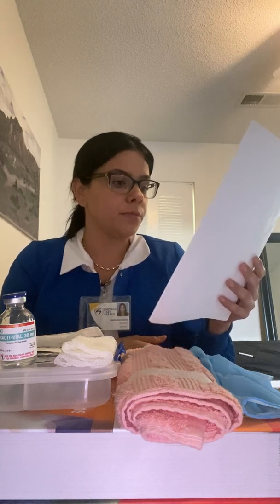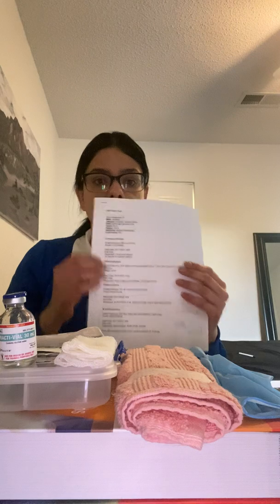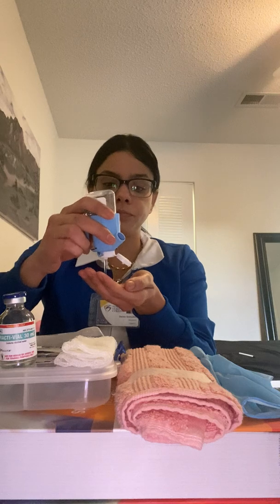And for Anna, we have an influenza vaccine. We have a 0.5 ml that is going to be given intramuscular to prevent the flu, and the time is now. So I have done my second check. Make sure that I'm giving the right medication to the right patient. I am going to wash my hands one more time, and I am going to start the process of getting the medication.